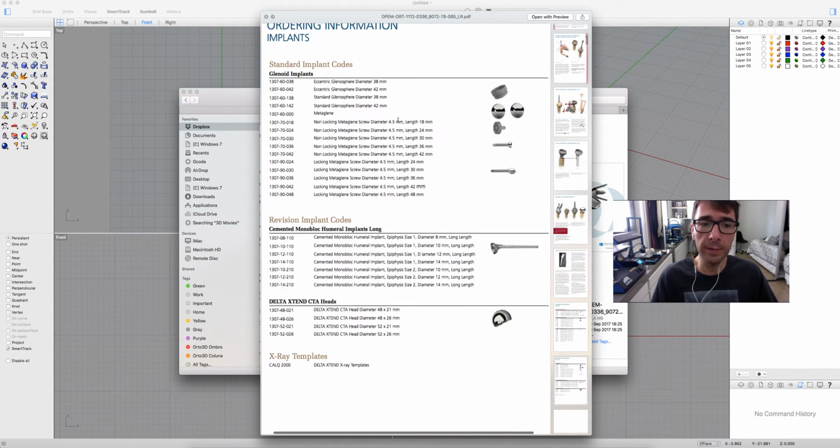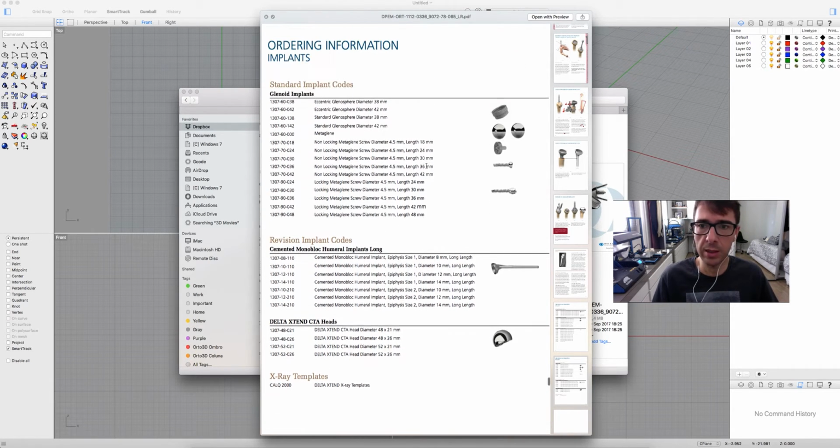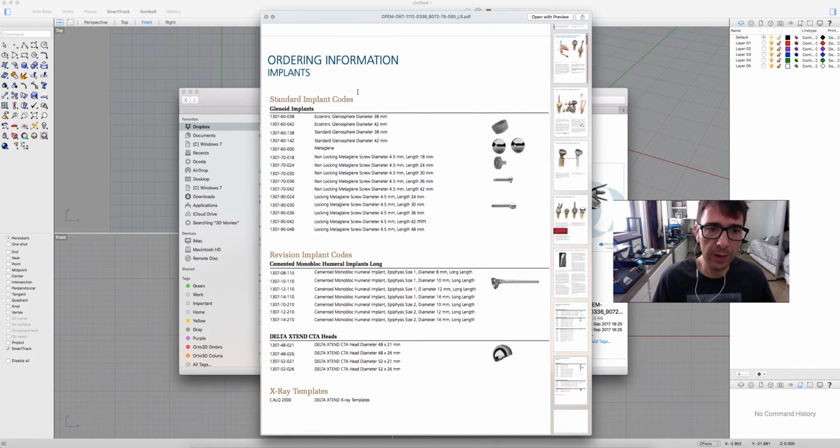And we have here the Metaglene, the base plate. So we have here a peg with 18 millimeters, 24, 30, 36, and 42. And we have the screws. The screws don't matter for us right now. We know, it's not written right here, that the base plate has 28 millimeters in diameter, okay? 28 millimeters in diameter. Let's write that.